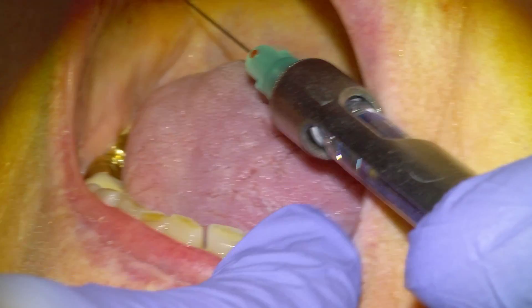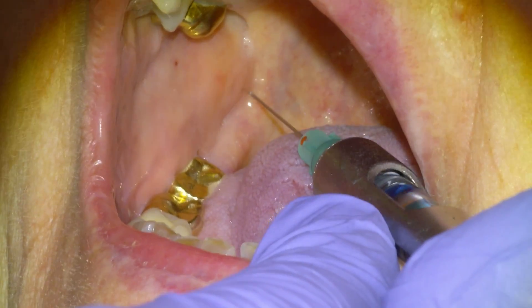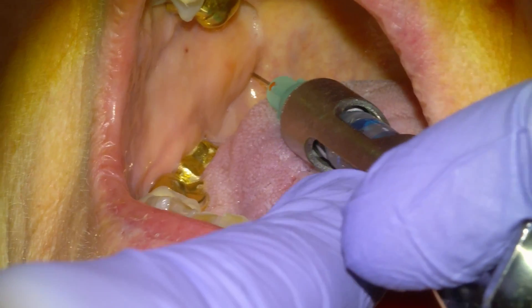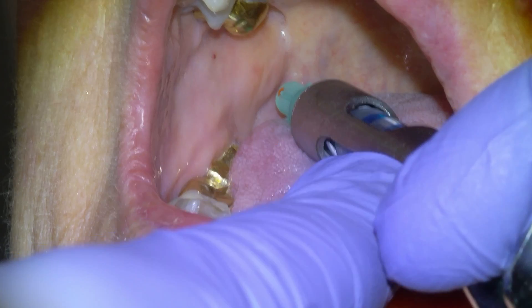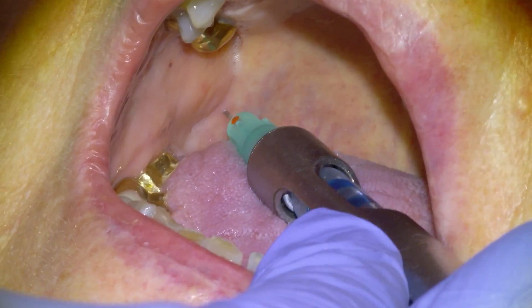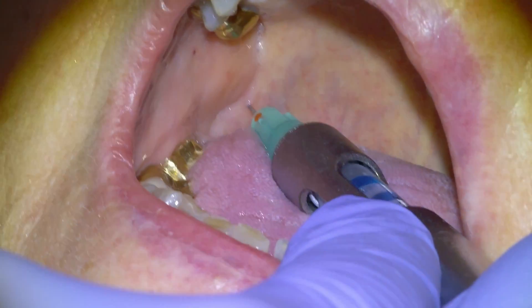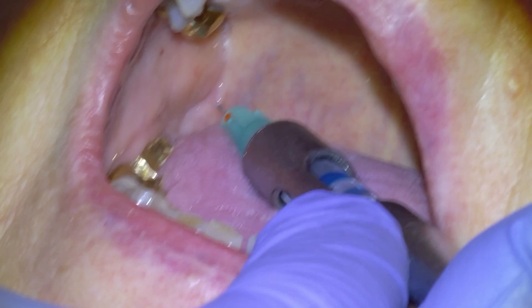I'm just going to poke the tongue to get it out of the way. You're going to feel a sharp pinch — you're going to be in there for about 30 seconds. Let them know they're going to feel a pinch and that occasionally they'll feel an electrical shock sensation in their tongue or their lip and chin, which is normal. Happens about 5% of the time. And then we're going to contact bone and start depositing our cartridge — about two thirds to three quarters of the cartridge.